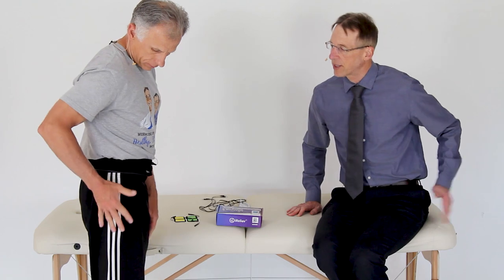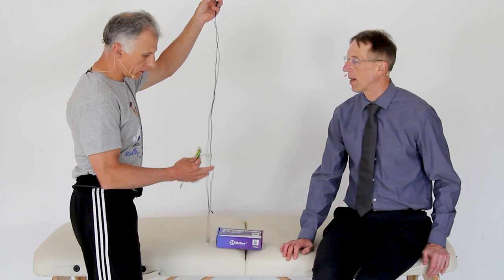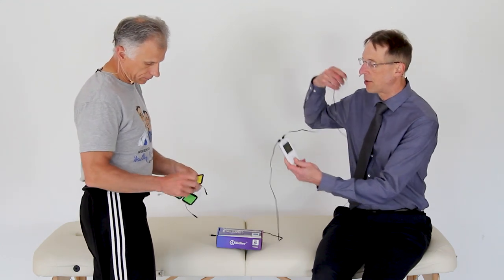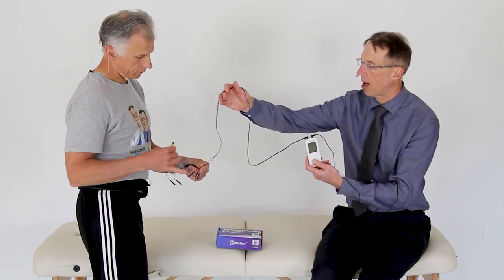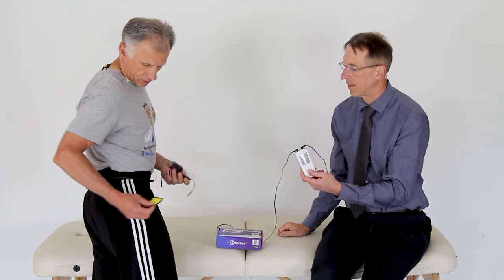So let's start off with this. Let's say hip pain, which generally is off to the side or maybe in the front. Let's say it's off to the side. You want to start with just maybe two pads. So here we've got the unit and we've got the leads on there. We're not going to connect the leads to the pads just because we're talking about placement, not connection and use of the unit. Most units have two leads, and one lead attaches to two pads. So we're going to start off with just channel one, going to a lead, going to two pads. There you go, so you'll have it hooked up.